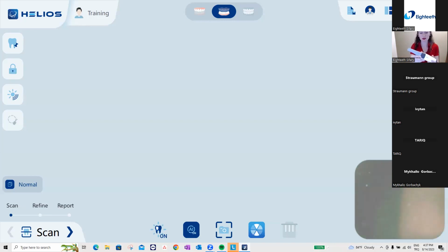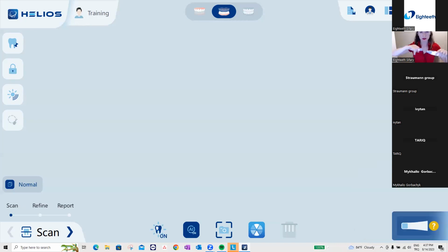All right, as I mentioned, there is a start stop button over there, and in the lower part there is a switching mode button over here. It's so easy. I just insert, you can just go in and out. Let me stop my screen first.